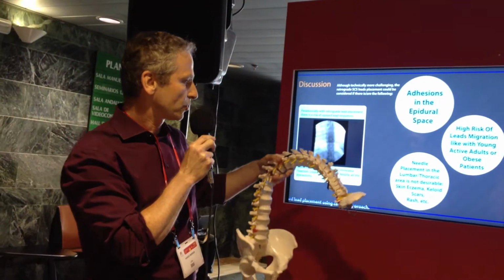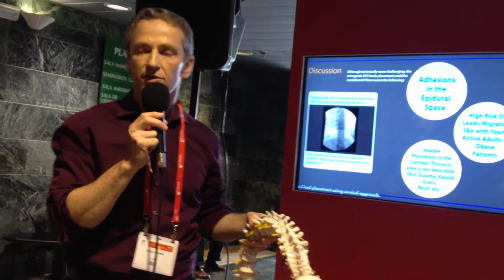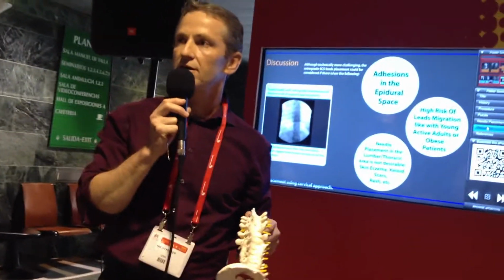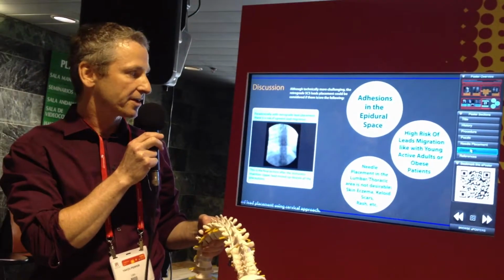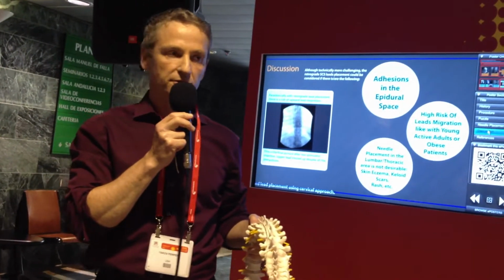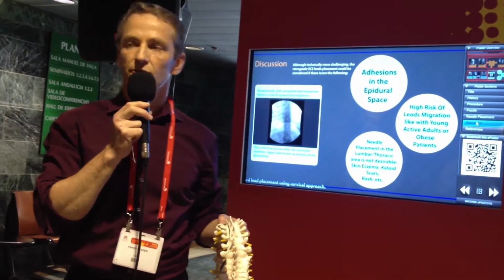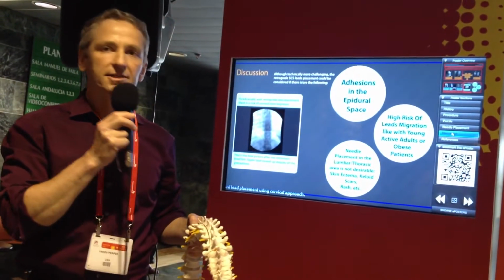In the case presented, there was some upward lead migration, but it wasn't significant and the pain coverage wasn't lost. To conclude, spinal cord stimulator placement using a retrograde cervical approach can be used when the traditional approach failed or when spinal cord stimulator lead migration is a big concern. However, further clinical studies are needed to balance the advantages of this new approach against the risk of utilizing the cervical spine for needle placement. Thank you for your attention.